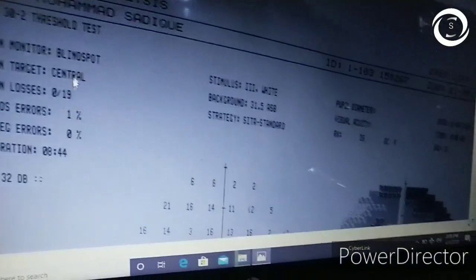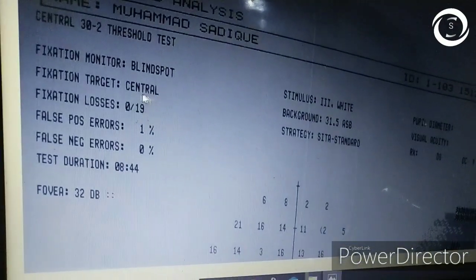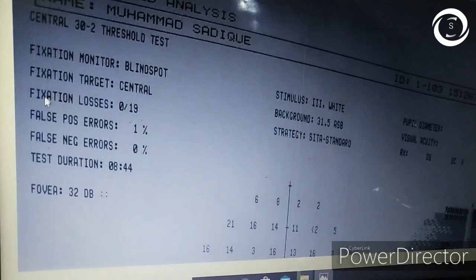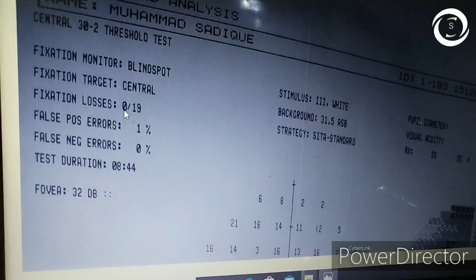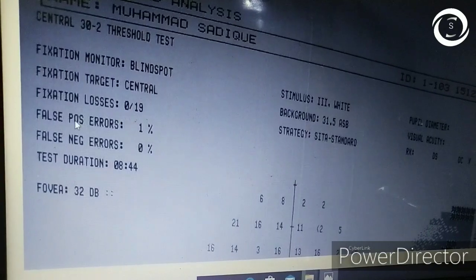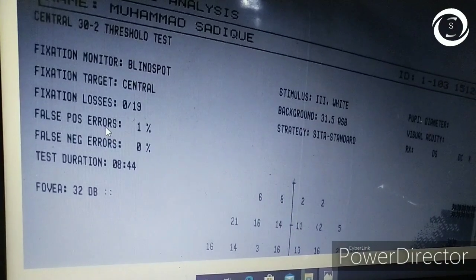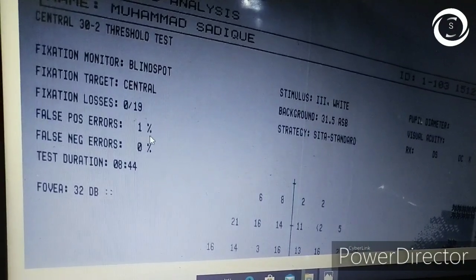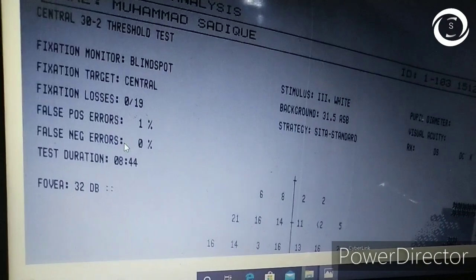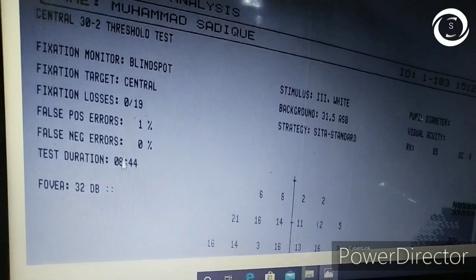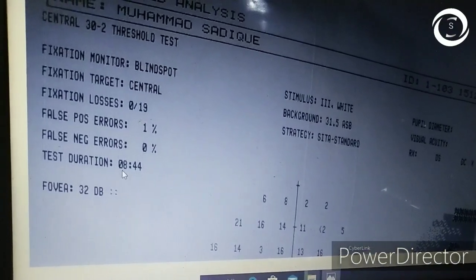Then comes the most important question: whether the visual field printout is reliable or not. Check the reliability indices — false positives, false negatives, and fixation losses. All should be less than one-third, or 33%, to make the test reliable. False positive means the patient is trigger-happy, pressing the button without visualizing a stimulus. False negative means the patient gets tired and misses a spot where they previously responded. Fixation losses measure how much the patient moves their eyes during the test.